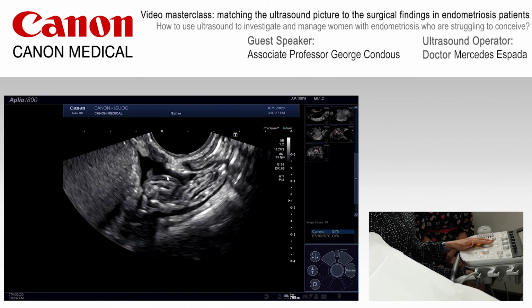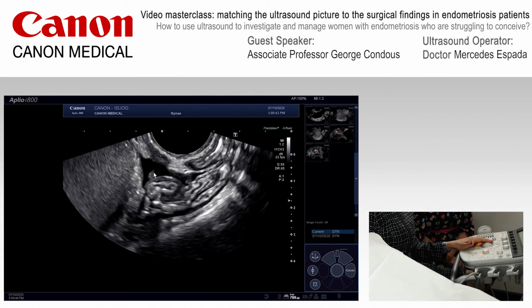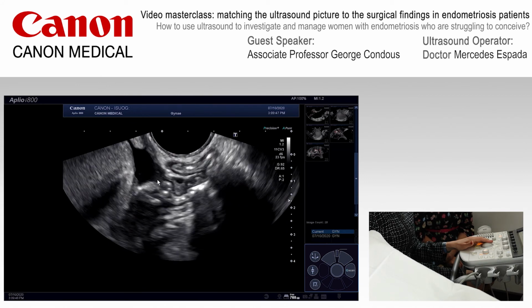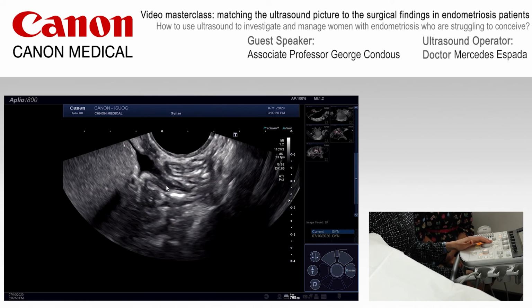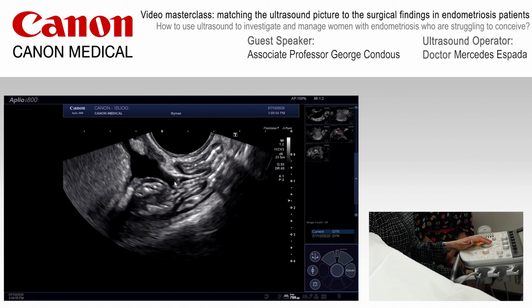We're fortunate now today to demonstrate our ability to visualize superficial endometriosis. Because this young woman has some fluid in the pouch of Douglas, we can see here that over the serosal surface of the rectum, there's a small tag coming into play just there, and it's almost literally like a flag waving in the breeze, and that would represent some superficial endometriosis over the surface of the rectum itself. And here's another area here.